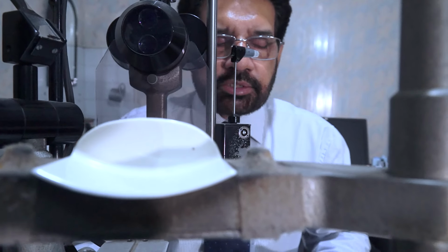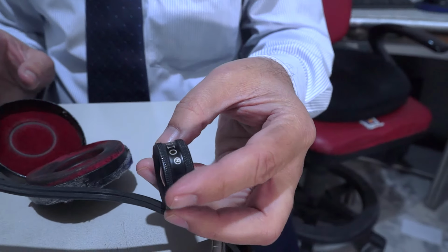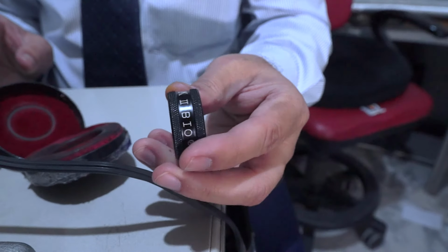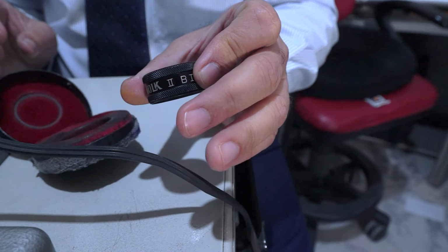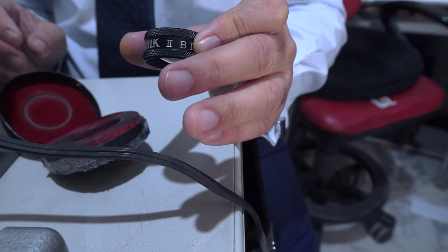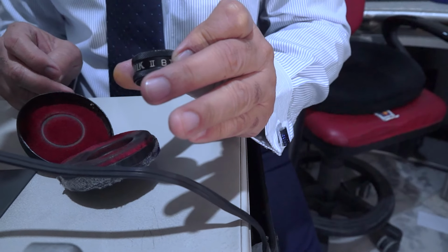There are other lenses for examination of the fundus. This is a 78 diopter lens. This is called fundus biomicroscopy, by which we can examine the fundus, which consists of the retina and the vitreous.